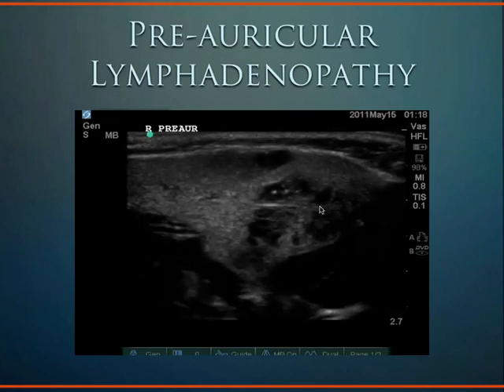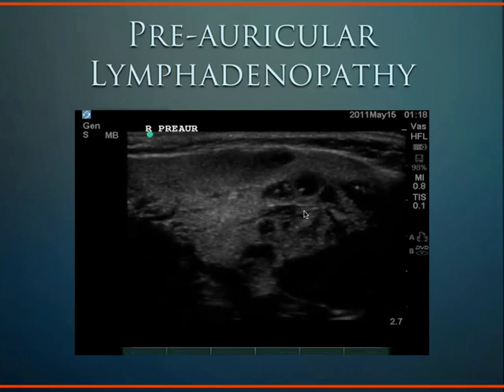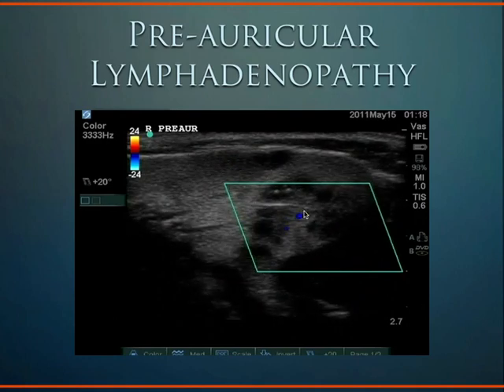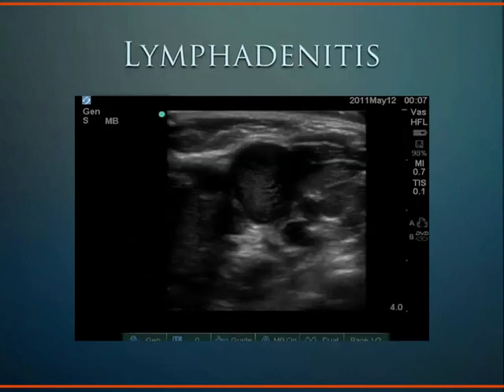These are the lymph nodes. We see there are about 3 preauricular deep lymph nodes. They number from 1 to 3, and they lie right in front of the tragus of the ear. Their afferents drain the lateral surface of the auricula and the skin of the adjacent part of the temporal region, and their efferents pass to the superior deep cervical glands.